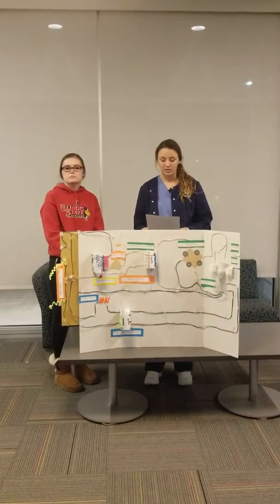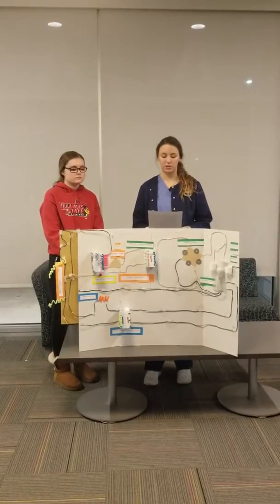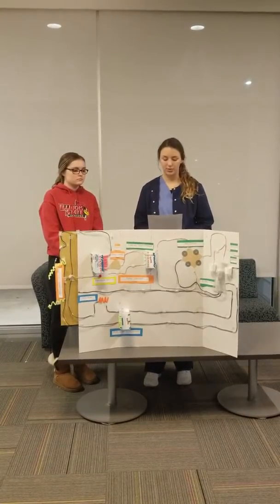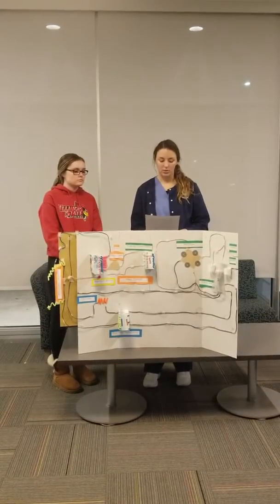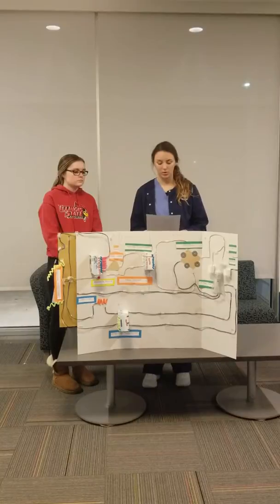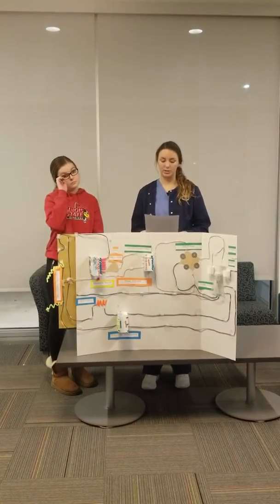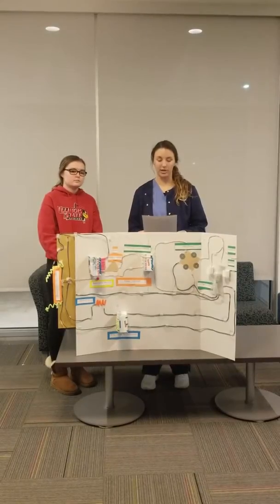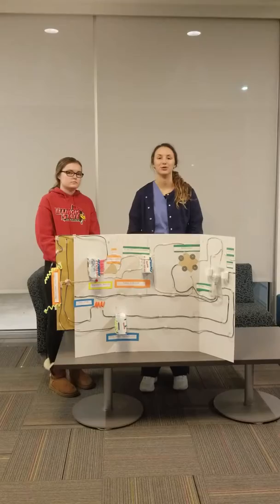The cathode is the negative end of the tube. The purpose of the cathode is to provide the source of electrons needed for X-ray production. The cathode contains the filaments and the focusing cup. Materials used in the cathode are tungsten wire, which has a high melting point and does not vaporize easily, thorium, which is added to increase thermionic emission for boiling off electrons, and the focusing cup is made of nickel. And that is the X-ray tube.